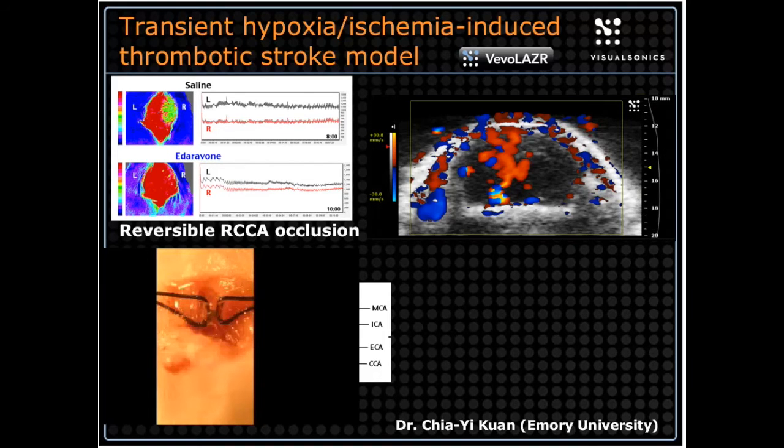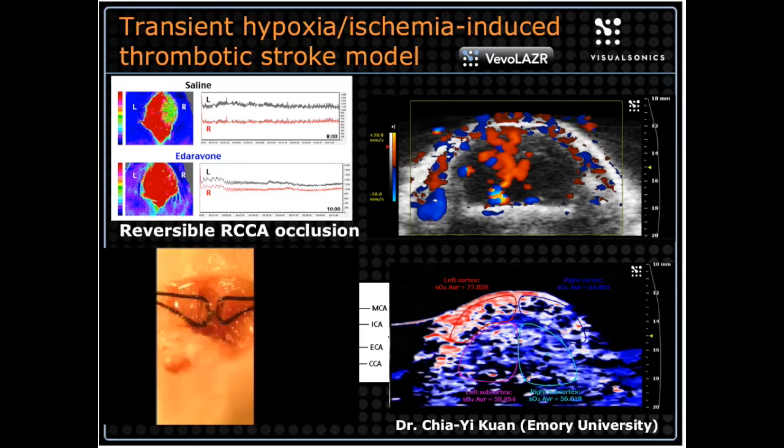Now, when looking at this, after tying off the common carotid artery, you see that one hemisphere remains highly perfused as indicated by a Doppler signal in red, whereas the other half of the brain, larger blood vessels no longer have blood flow inside. Whereas looking at with photoacoustics at the hemoglobin oxygenation levels, you see that both hemispheres still have oxygen levels, just that the right side has lower levels. And you get this information as opposed to the laser Doppler also at depth throughout the entire brain.